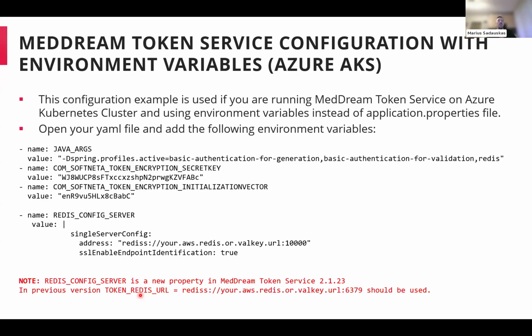So in principle, these are all the configuration settings regarding Redis and Valkey: how to configure your MedDream, how to configure your token service, so you can try it, test it to see how it works and play with it.